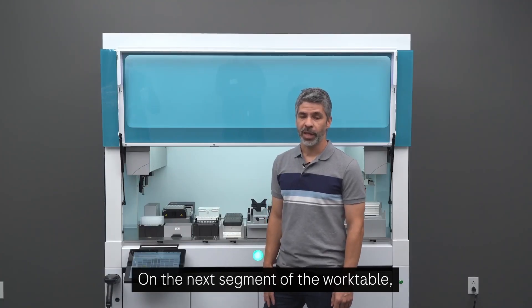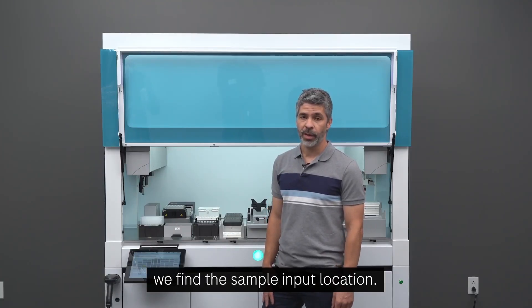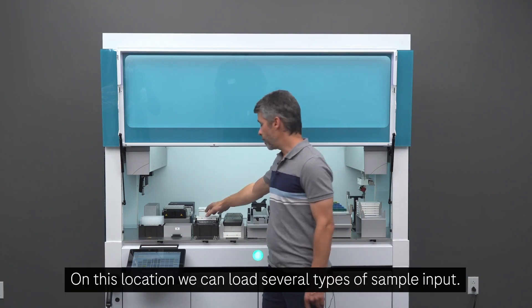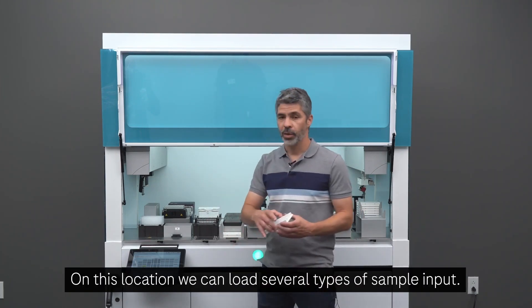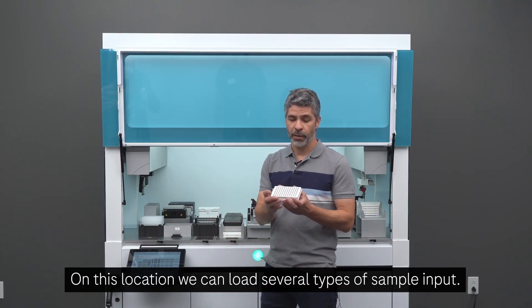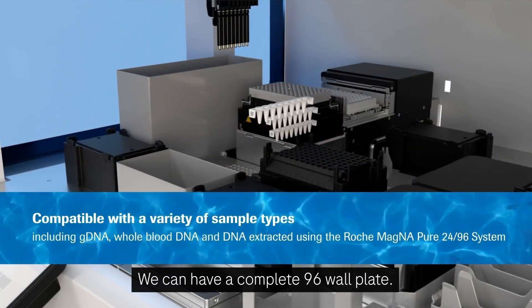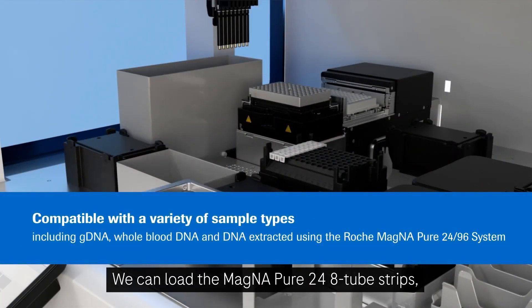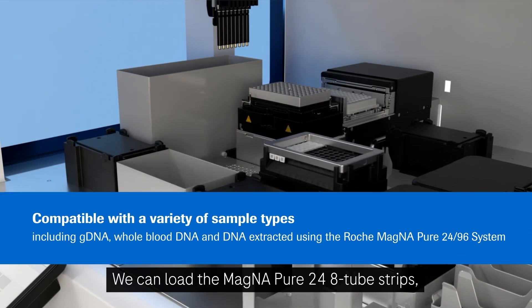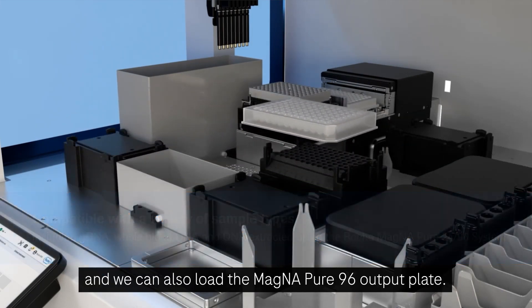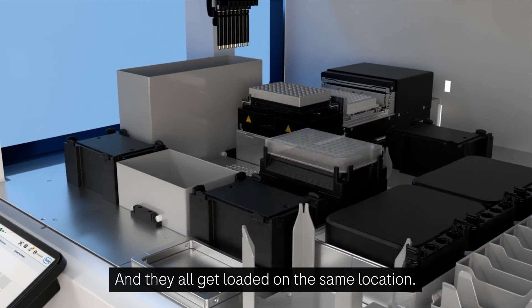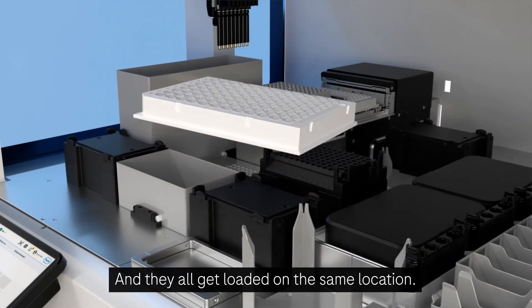On the next segment of the work table, we find the sample input location. On this location, we can load several types of sample input. We can have a complete 96-well plate. We can load the MagNA Pure 24 8-tube strips. And we can also load the MagNA Pure 96 output plate. And they all get loaded on the same location.